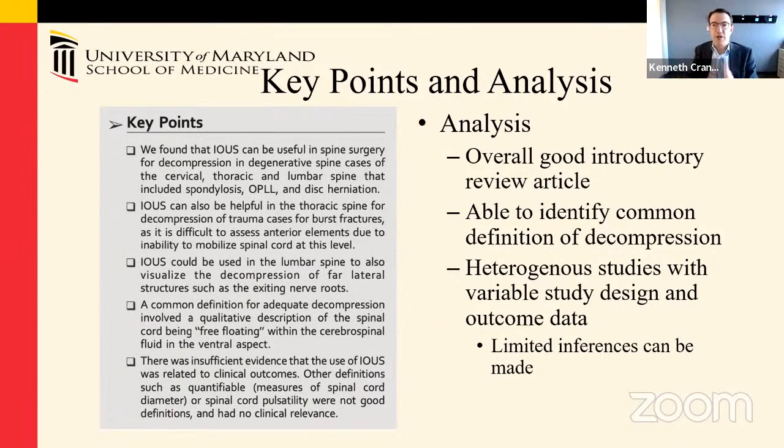So first of all, you can actually use the same machine that the anesthesiologist uses to put in lines. It's just that the probe's a little bit big, so sometimes you have difficulties fitting it. But I do that because at one of the satellite hospitals that I work at, they don't have the expensive intraoperative ultrasound machine that we have at the university. So I do use one of the other probes, and it works. You just have to try to get it to fit in there.